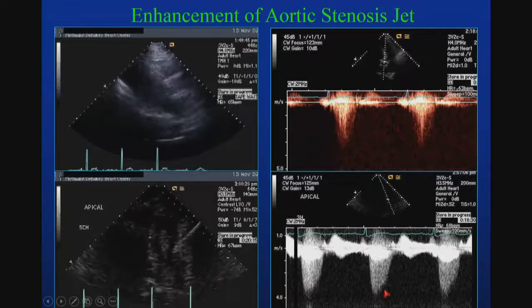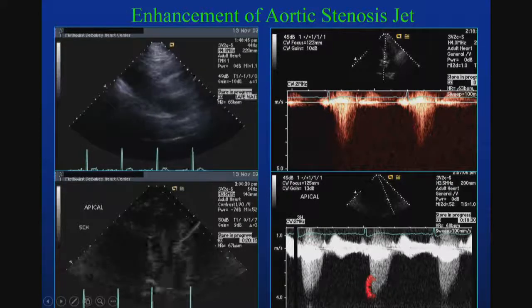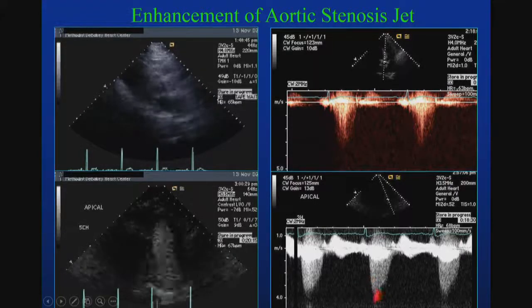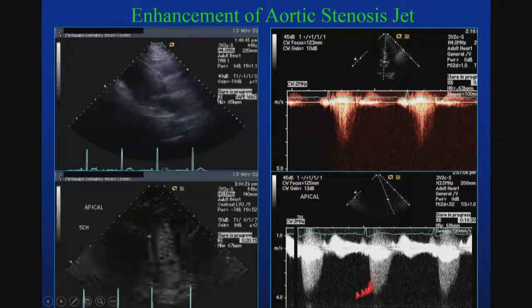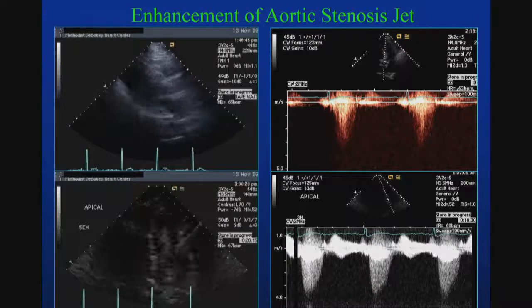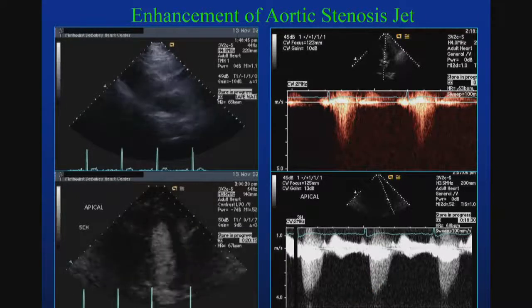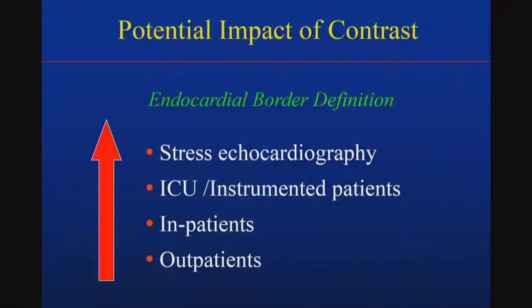You've got to be careful. If you have too much contrast, it will enhance it too much, and you'll have almost half a meter or so extra, I wouldn't say just over signal, if you will. So you have to wait for it to die down a little bit so you don't overestimate the velocity and therefore the gradient. So you have to be careful about that.